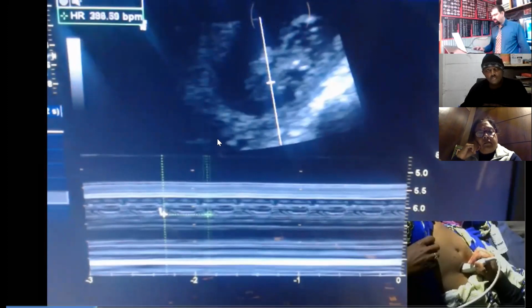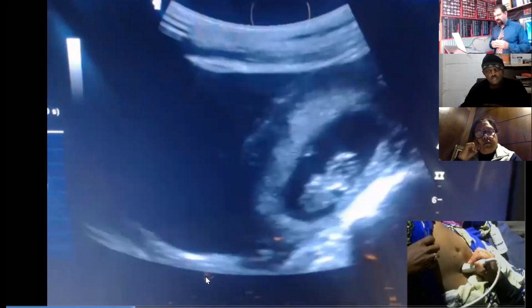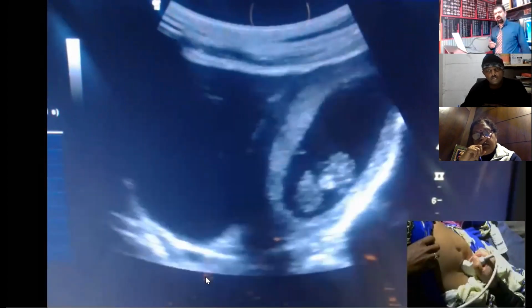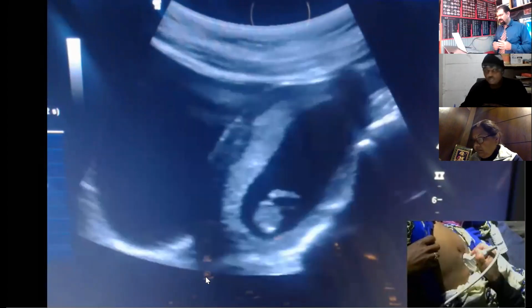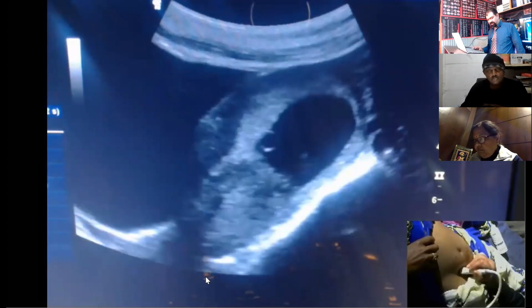Then I will go to the M mode and I will see these pulsations. How to take? I have to take it on alternate basis. What I mean by alternate basis, you have to take first, you have to skip the second one, and you have to freeze on to the third pulsation. So then on setting, a pop-up will appear over there of the fetal heart rate.